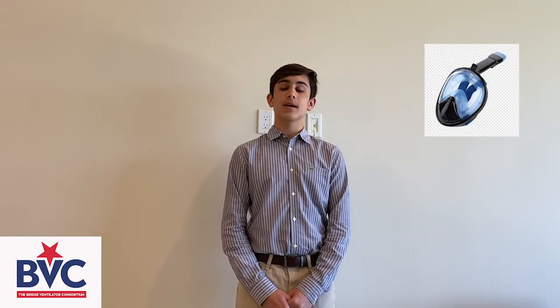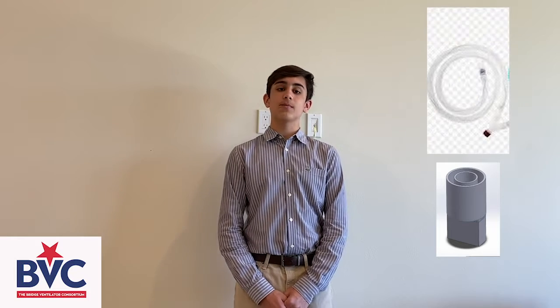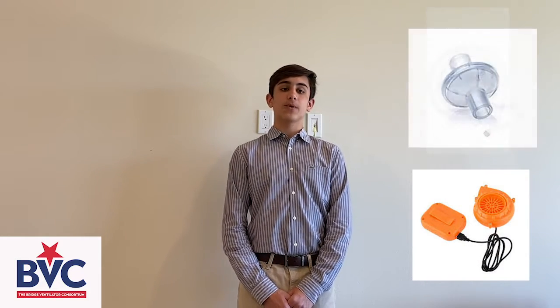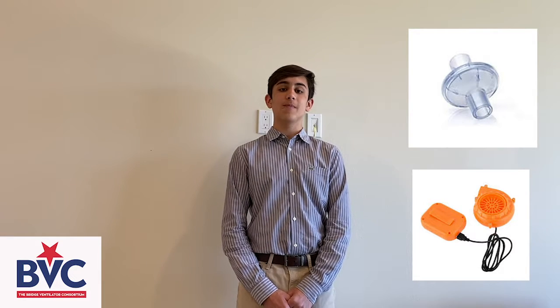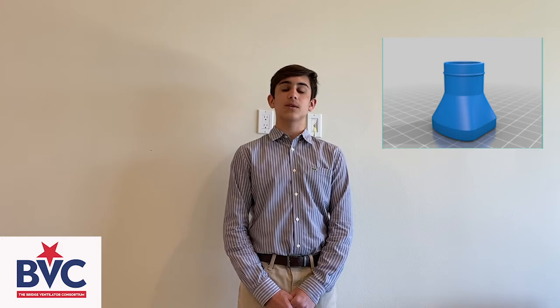Thus, Ms. Ellen Wong and myself worked to rectify this problem by creating a model of a PAPR mask that can be easily created by the general public using basic supplies. We used a full-face snorkel mask connected to the rest of the ventilator system using 3D printed jigs. Tubing was added with a portable fan in order to make breathing easier for the user. An airway breathing filter was affixed to the fan so as to limit bacteria and viruses from coming through the mask. These parts were connected using 3D printed models.